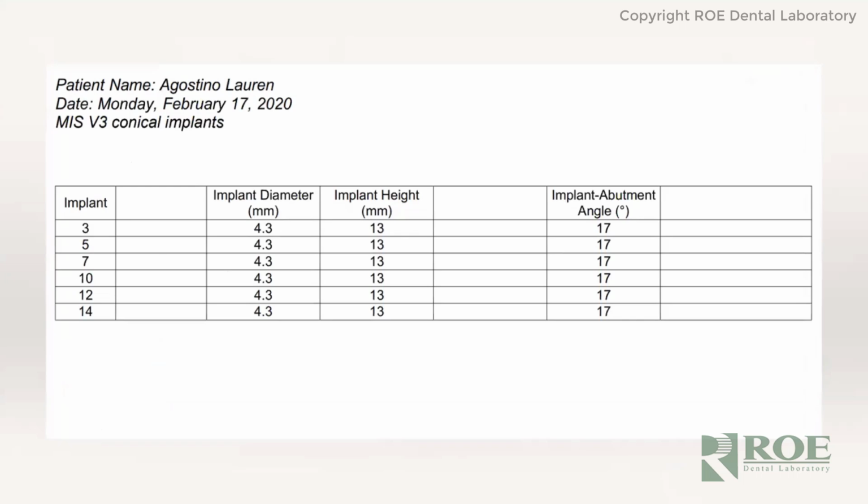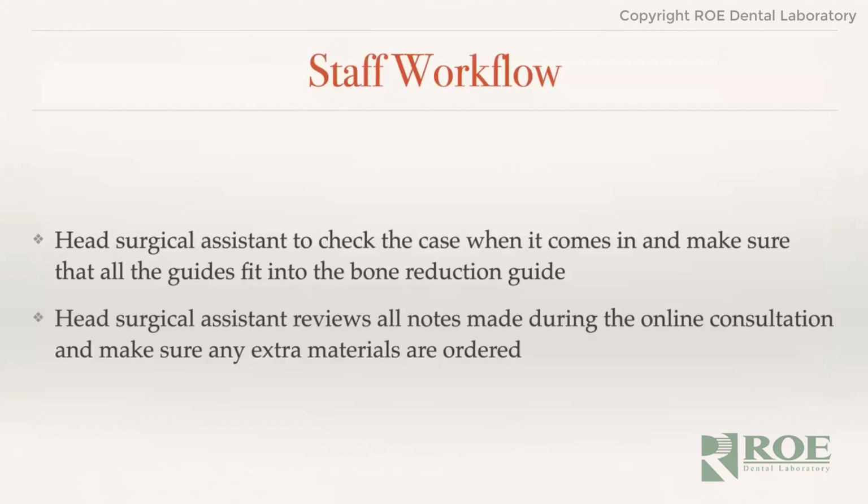And then when you open up the attachment file, they will see the size of the implants. They'll also see the implant abutment angles. They'll also know that they need to have straight and 30 degrees available just in case something happens.